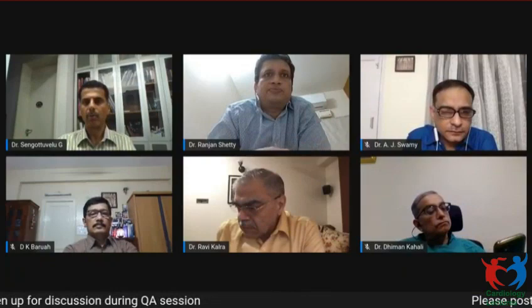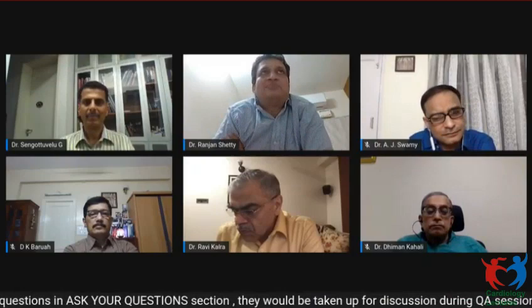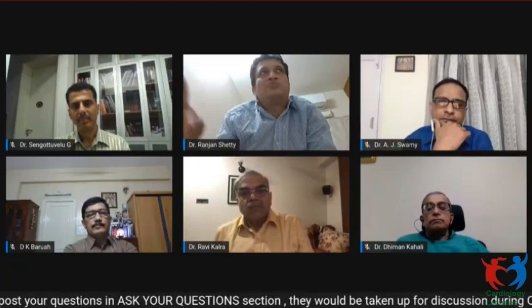Yes. Thank you, Dr. Velu. Dr. Ajay, excellent talk. I think you have summarized everything that everybody needs to know. The importance of DK crush comes in its data, the fact that its data is almost as good as a single stent strategy, and it gives you two stents with an extremely good result. Now, we are all a little worried about DK crush because of the number of steps, and it looks very complex. But honestly, it's not that tough.